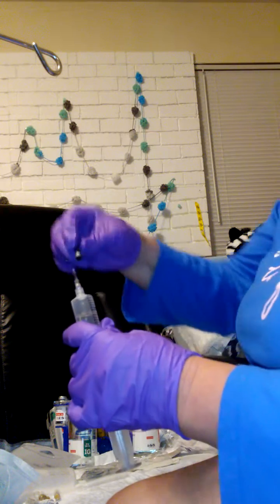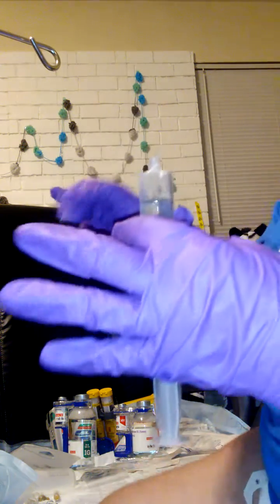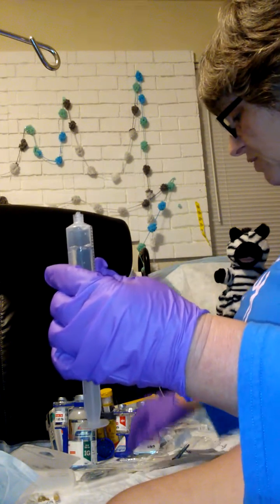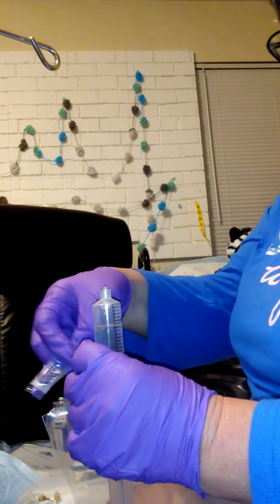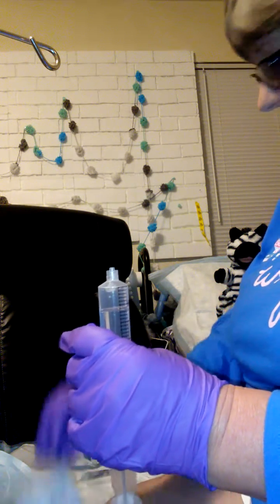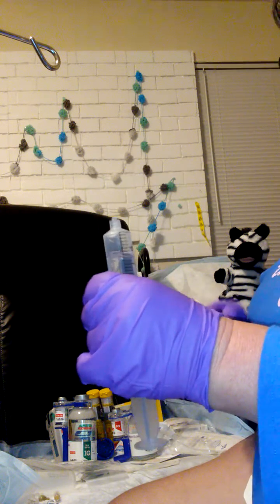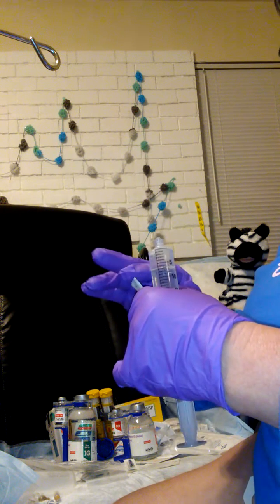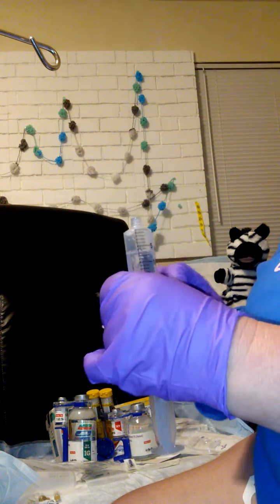Okay. Now I know that this is still a clean needle, and it just dropped on the floor, but because I have on gloves, I'm not going to pick that up right now and contaminate what I have already cleaned up. I am going to carefully, I don't want to spill any of this, put all of these little pieces in here. And since that's not a really sharp needle, it's a blunt needle, I'm not going to be in a panic over that. I don't have any little people in my house that will get into that, pick it up.